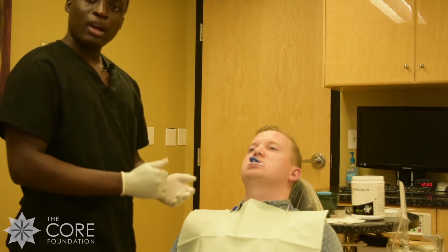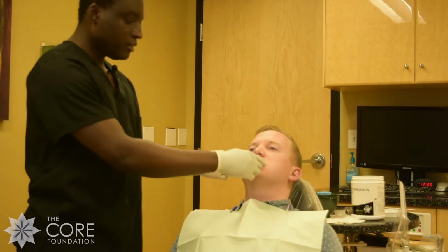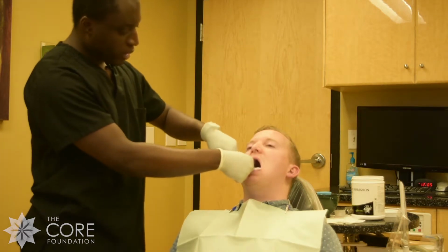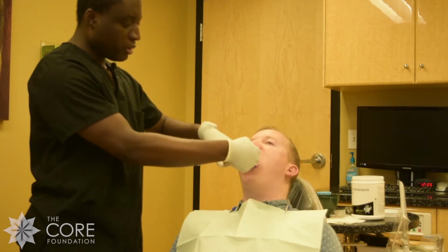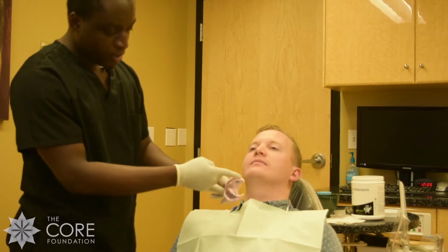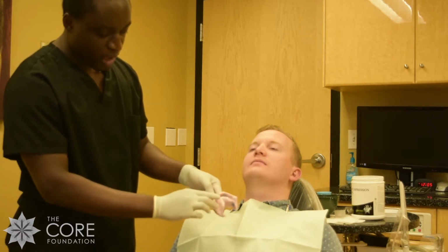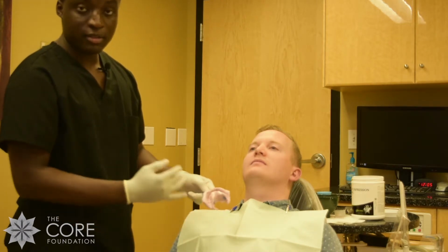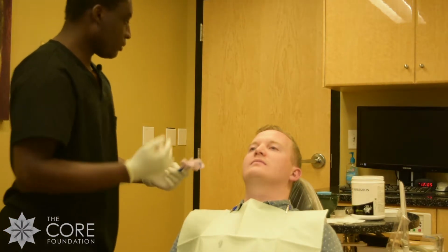All right, we've waited about 45 seconds. This impression is really hard and set. We're gonna have our patient open his mouth. We'll slowly pull it out. And then when you look, you see all his teeth are covered. We also have a little nice flap, and we even have room for the tongue in here. So this is also a great impression.